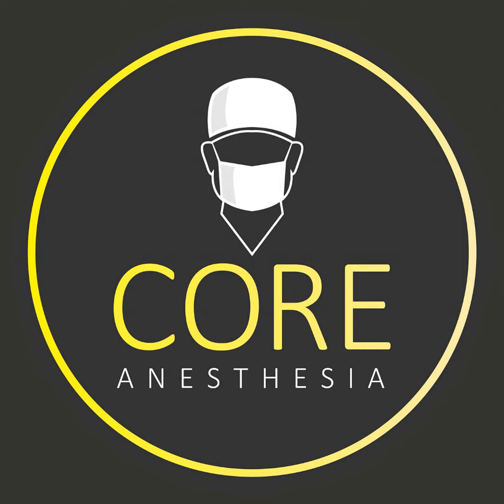Awesome. So next we want to go into arterial waveforms. So why would we want to use an invasive arterial line as opposed to our typical blood pressure cuff? Well, this gives us more of a video picture of our blood pressure as opposed to a snapshot picture that we would get from a cuff. The thing I like about it is it's a continual waveform.